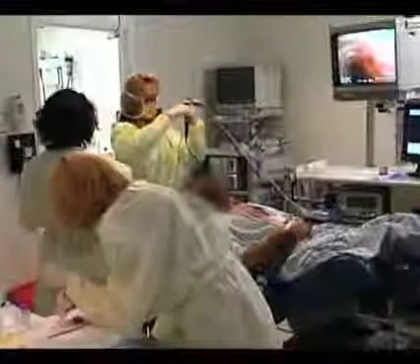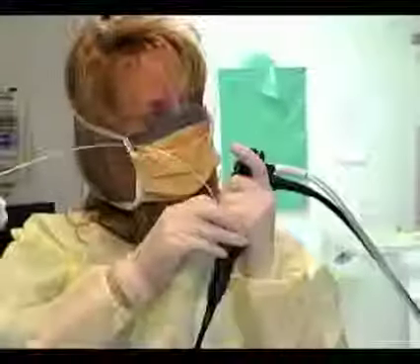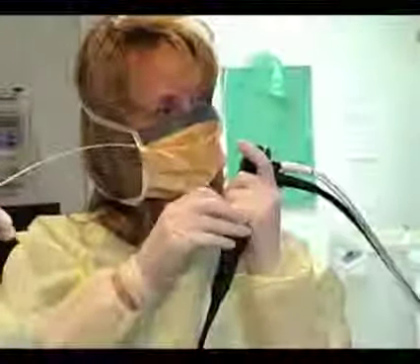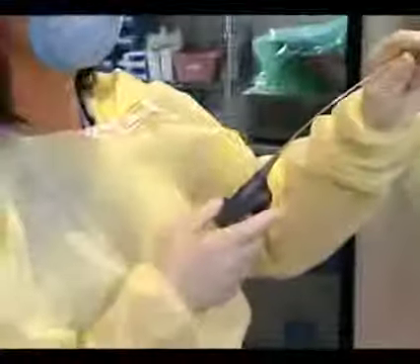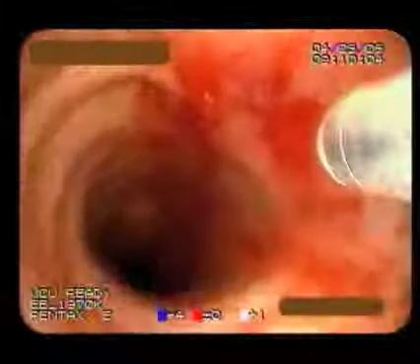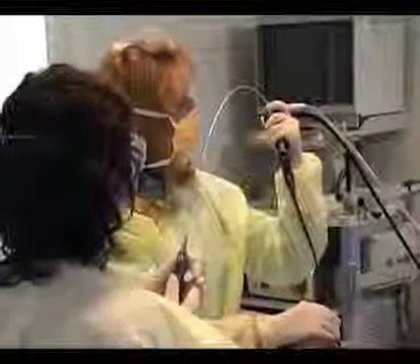So I like to approach the different angles, but the key is getting between the inner cartilaginous rings, getting not parallel down the respiratory mucosa, but actually you want to go perpendicular into the lesion in question in order to get ample tissue. And another benefit with this needle is that it does have durability. I can make multiple passes without kinking of the guide wire and the stylet, which allows me to be effective in taking more biopsies. If you have cytopathology on site, then another option is you may have your answer with the first pass. Needle out.